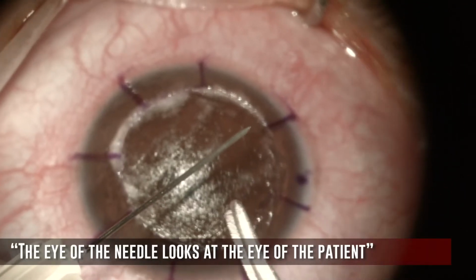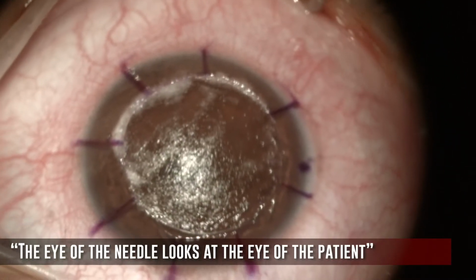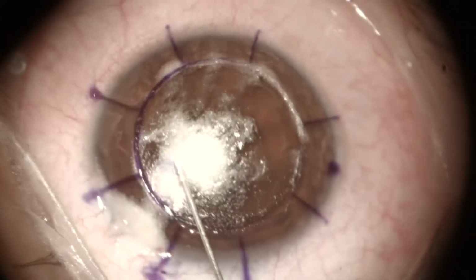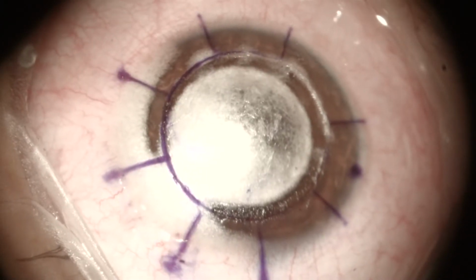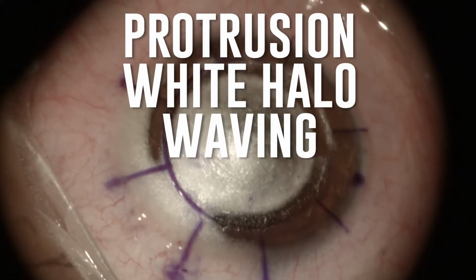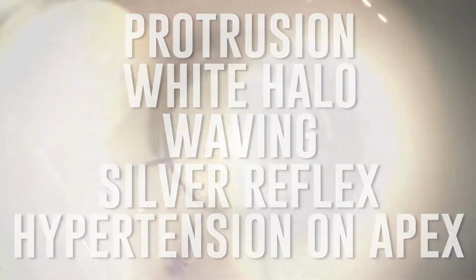It is imperative to bend the needle bevel down. The eye of the needle looks at the eye of the patient. The air should be injected in a gentle manner. When the big bubble forms correctly and it is evident to the naked eye, we can see the following signs: protrusion, white halo, waving, silver reflex, and hypertension on the apex.